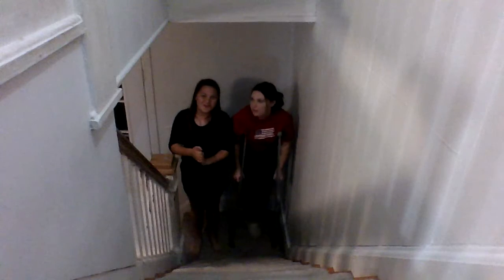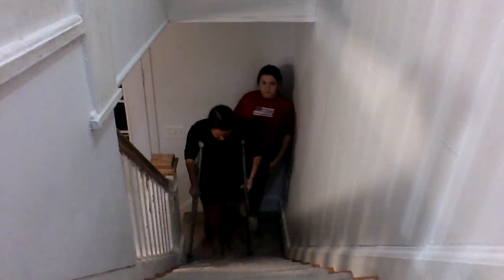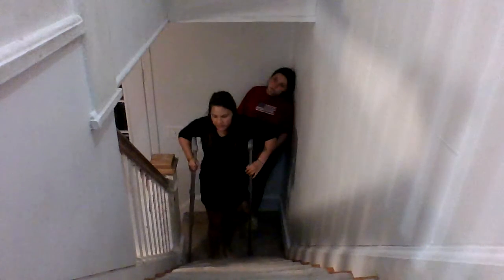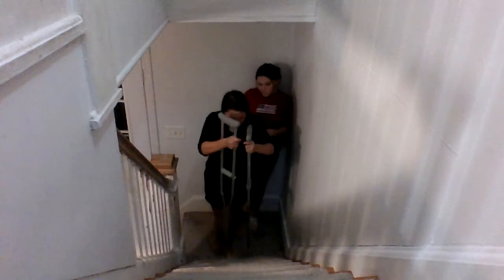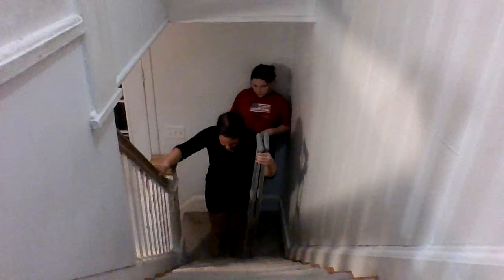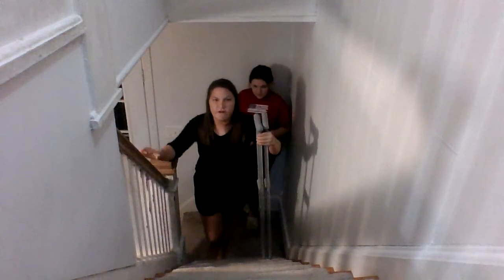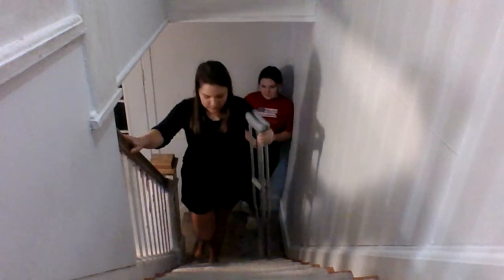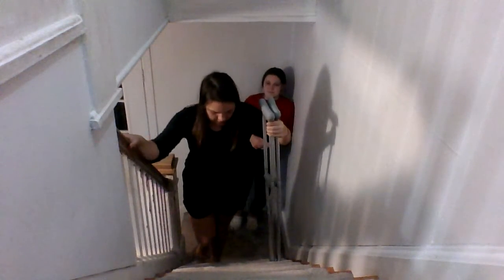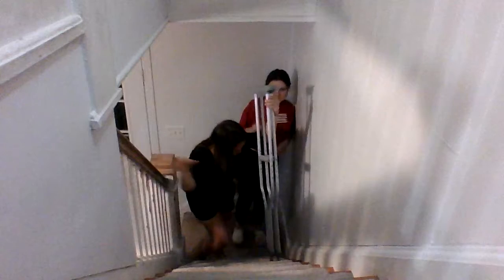Now we are going to go up the stairs with the crutches so you can see them. You're going to stand as close as you can to the bottom stair. Since we have a hand railing, you're going to put your hand on the hand railing, you're going to hop up. Keep doing that for five stairs, so Anna go up five.